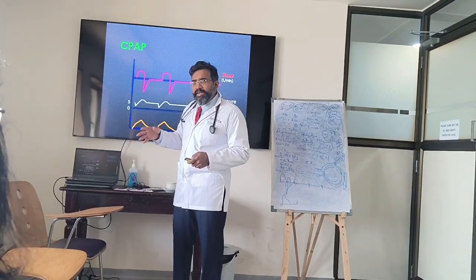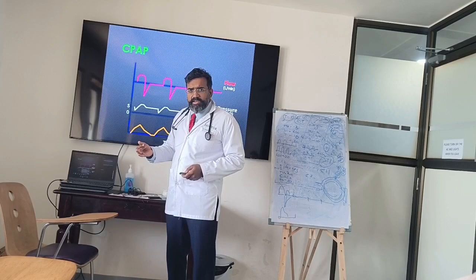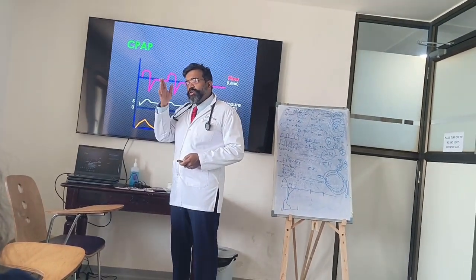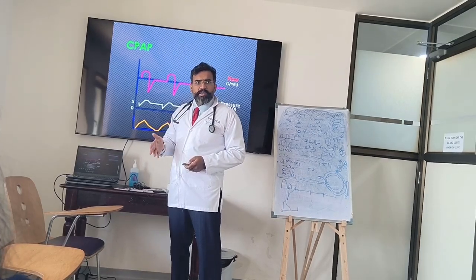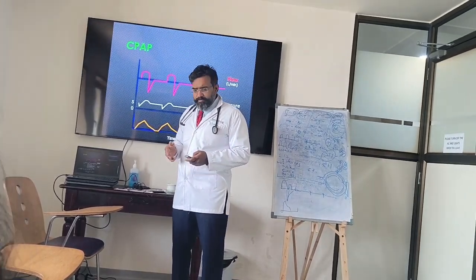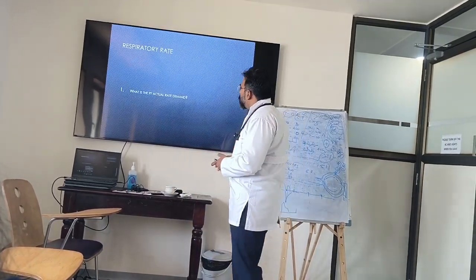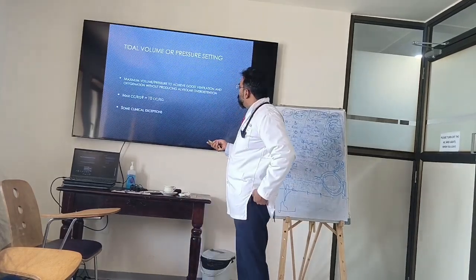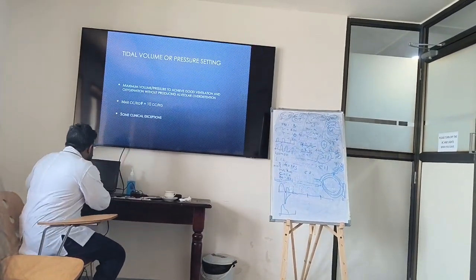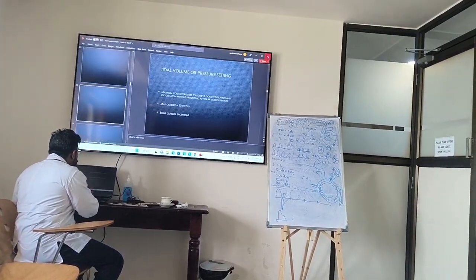The only thing you have added, everything is variable here. RR is variable, the pressure is variable, the volume is variable. So in CPAP, I want to see tidal volumes, pressures, RR, all of these things. You're understanding? So with spontaneous effort, you know the patient's actual rate demand. So let us go to the waveforms to see exactly how it will look on the ventilator.